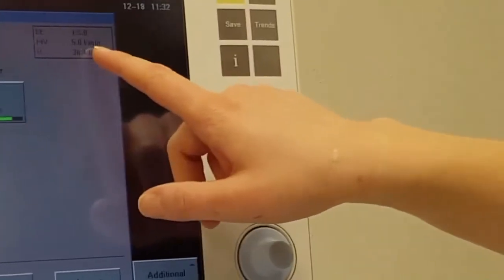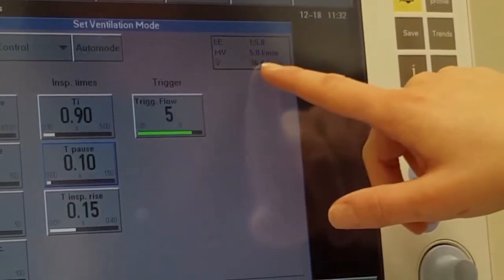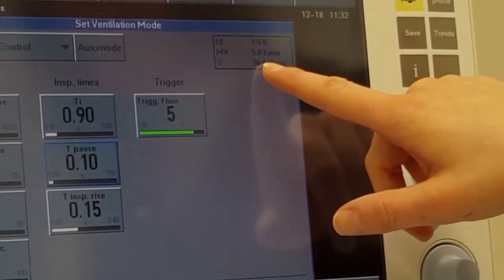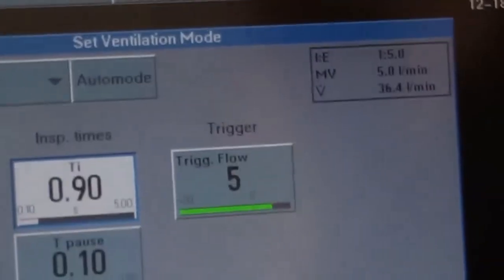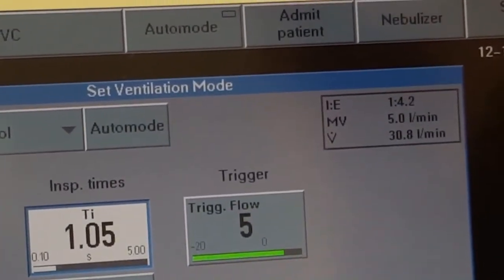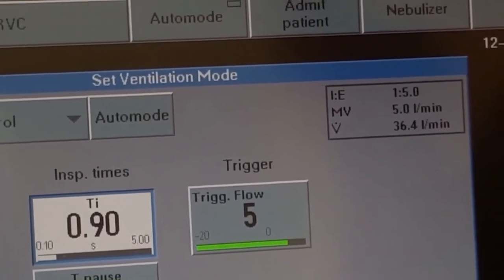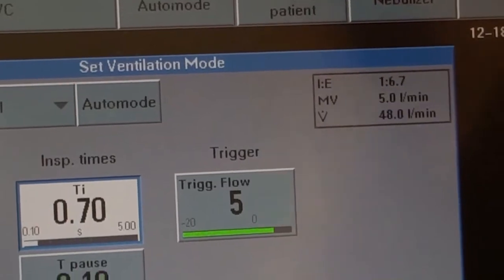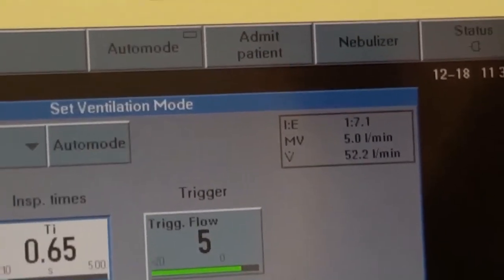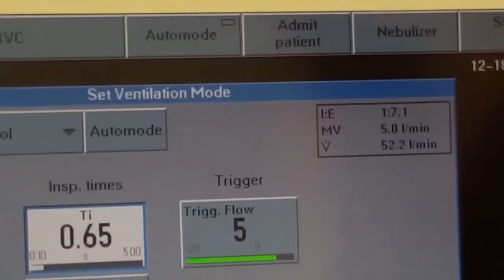So in the top right, you can see it has our I:E ratio, our minute ventilation, and our flow. So right now we're at 36.4. If we go to our I time, we can adjust that down, which increases our flow, or up, which will decrease our flow. So we want a flow of about 50. So we can do 48 or 52.